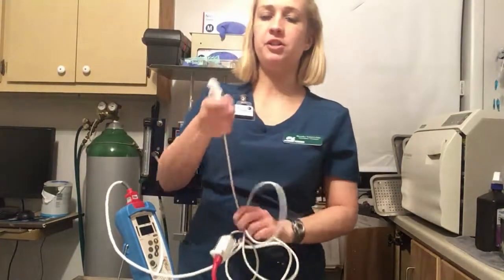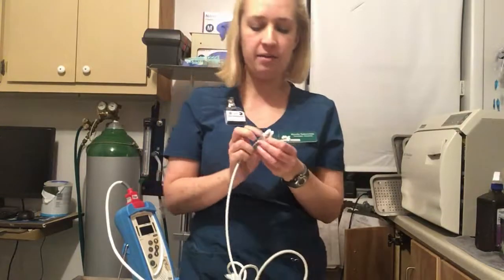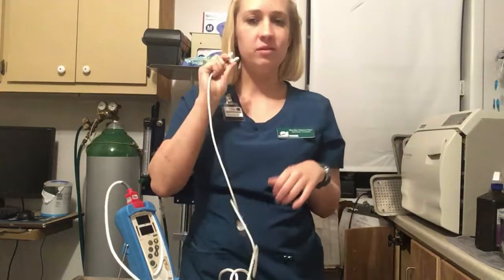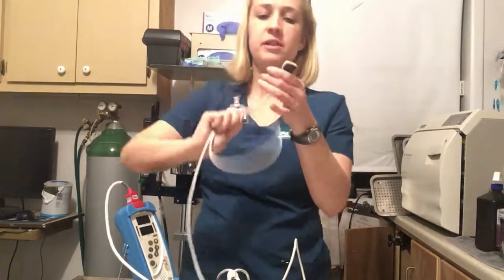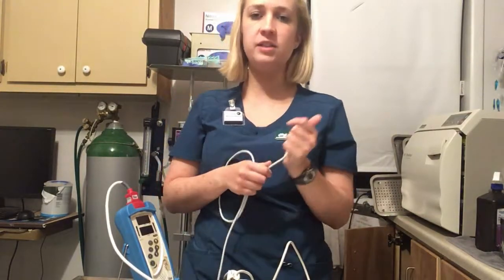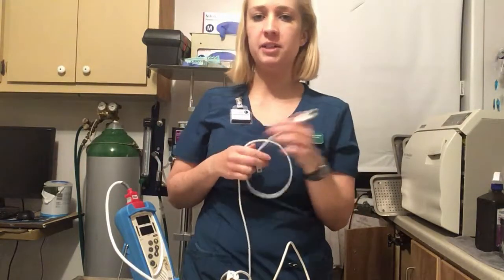When you're putting it on the patient, there's two different little ends that we have. The first one is this little clamp. You can put it on their tongue or on their ear, kind of a fleshy part that's really close to some veins. The other way is with this little end right here. This end you can put on the pads of their feet, or we commonly put it at the base of their tail. We'll shave a little area of hair and put it at the base of their tail, right where that vein is.